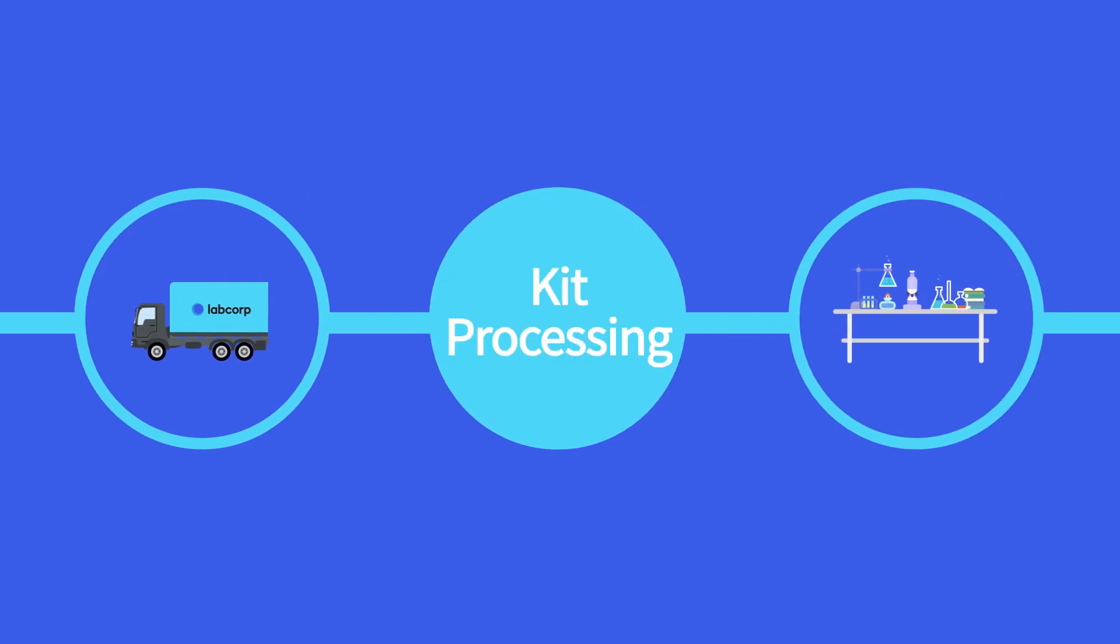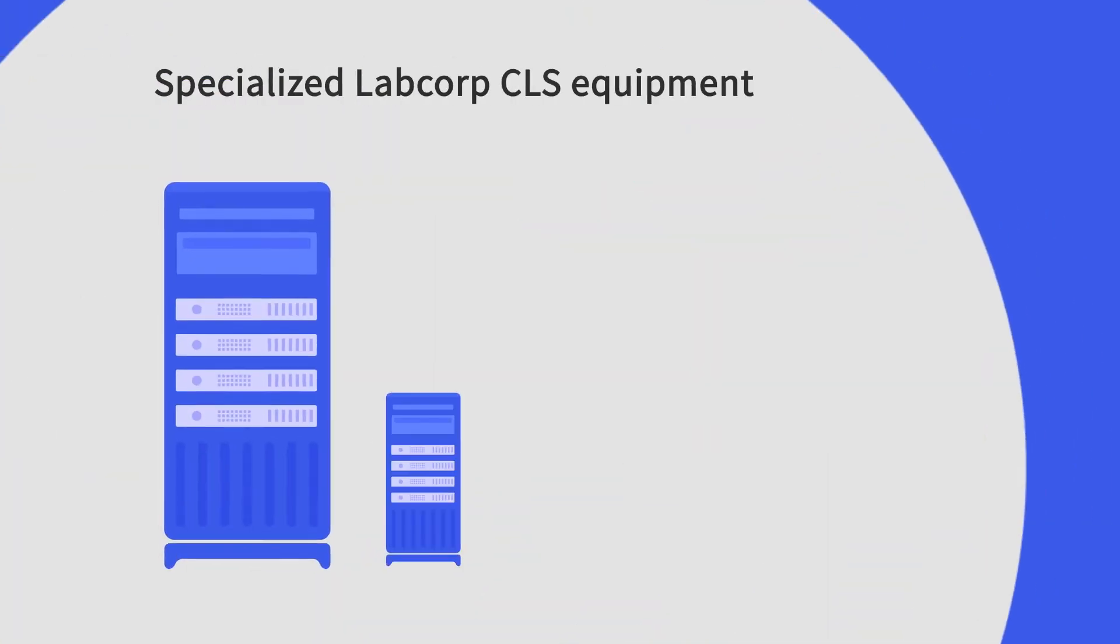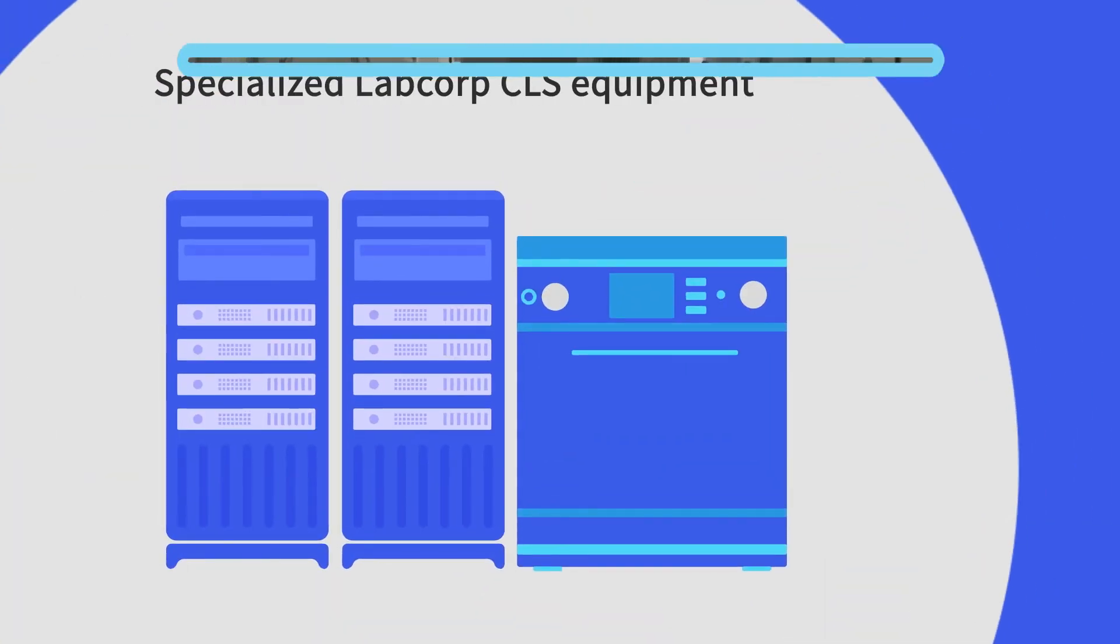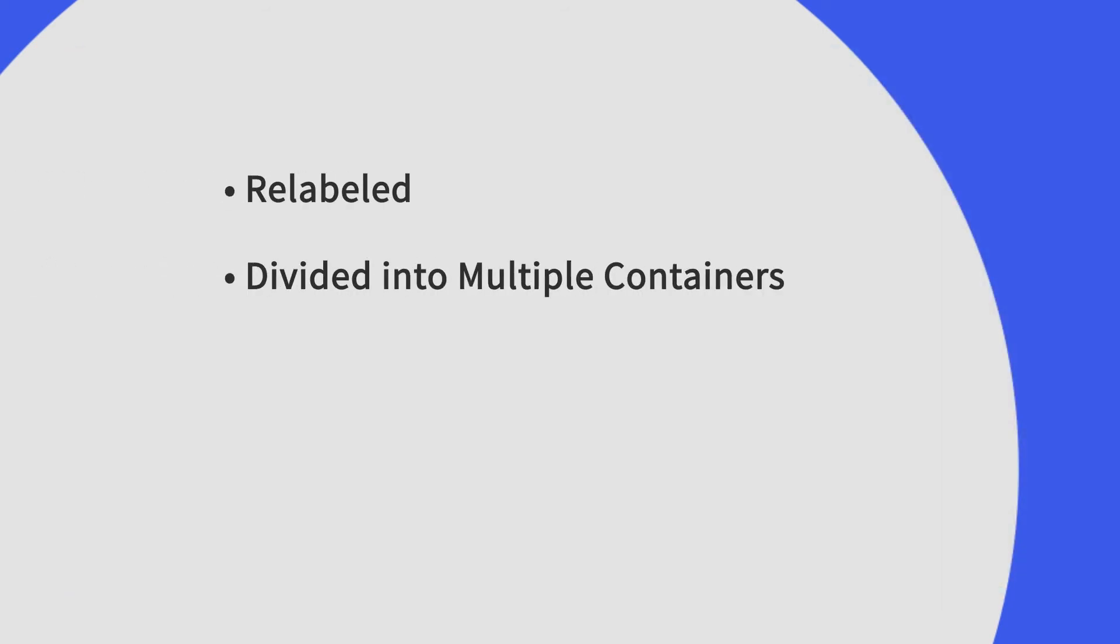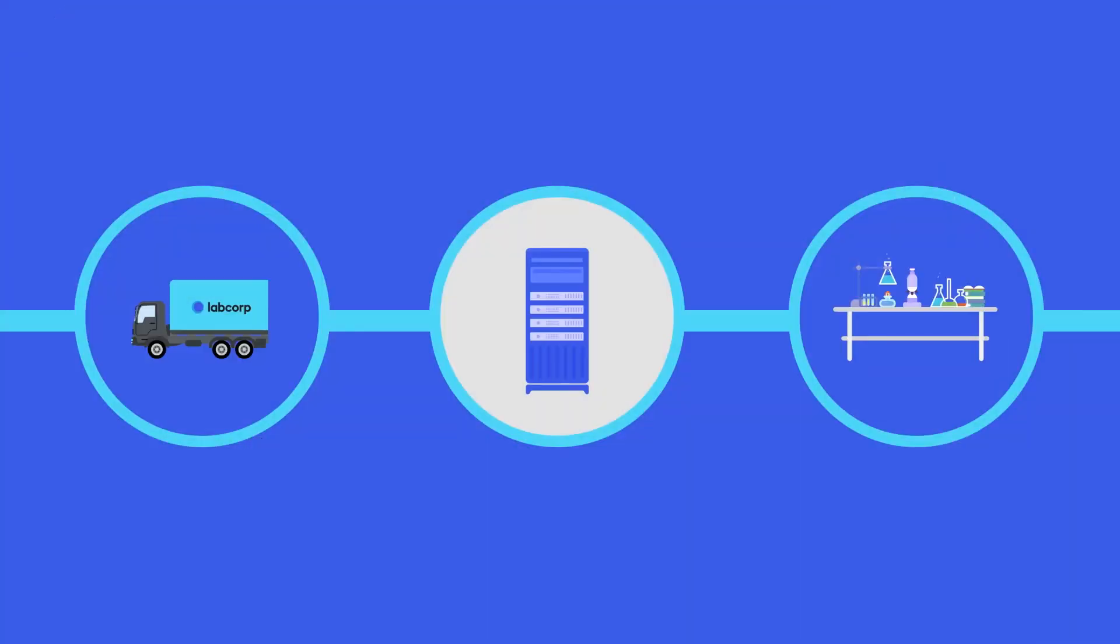Once a specimen collection sample is registered, it is processed using specialized equipment. Some samples are automatically distributed to the appropriate area of the lab for testing. Other samples might be relabeled, divided into multiple containers for different kinds of tests, shipped to other locations for specialty testing, or distributed for storage.